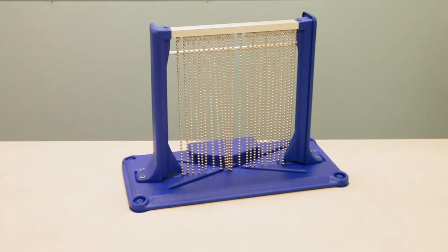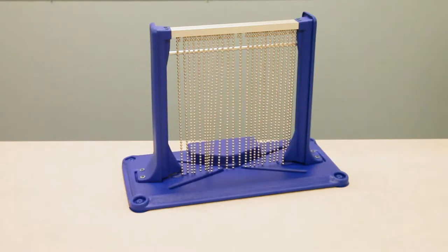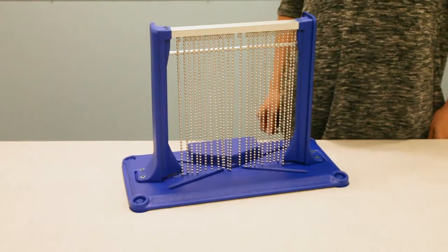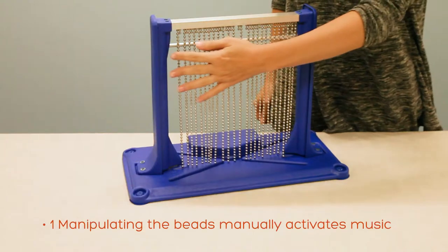This is item number 357, the somatosensory musical bead chain switch. The item can be used two different ways. The first way is by manipulating the beads for music.